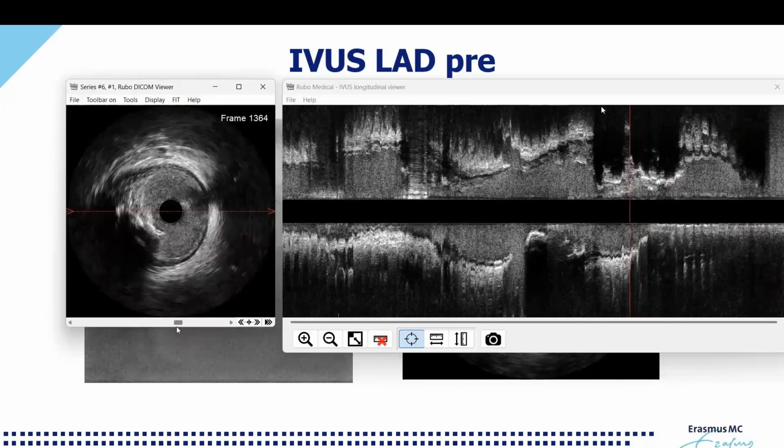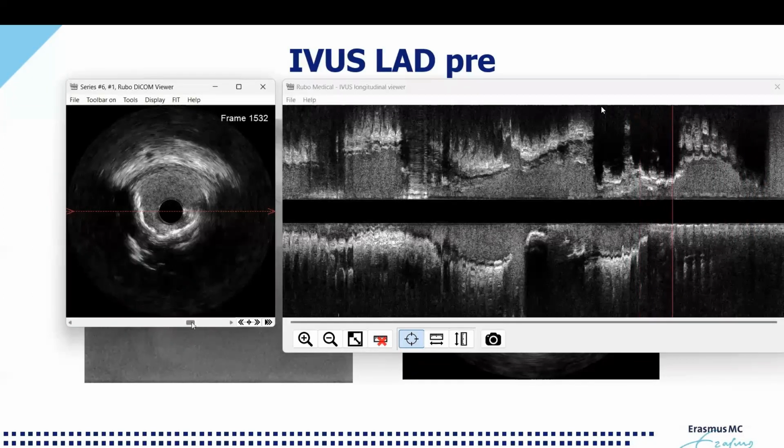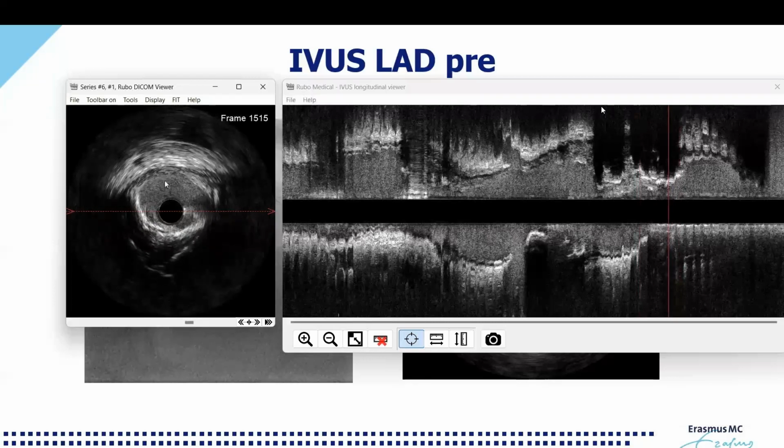Actually, this was the ostium. Here's the circumflex. And then we have the distal left main. Now let's measure this one. 5.5. And then we go also to a paper that compares the left main with FFR, that below 6 square millimeters, depending on what part of the world you live, it's very likely that you have a positive FFR.